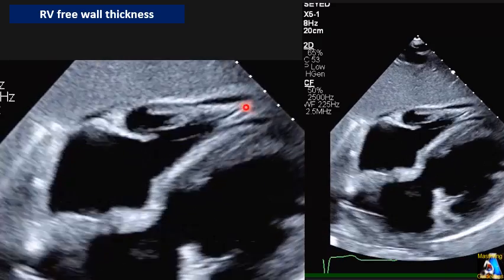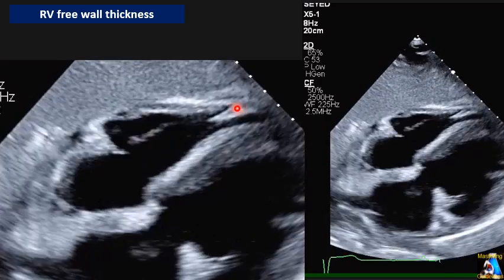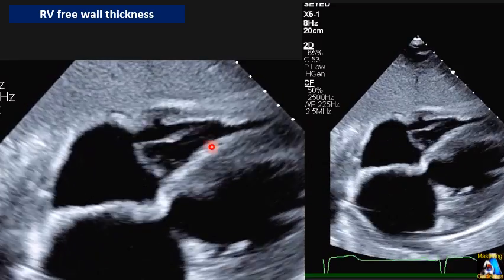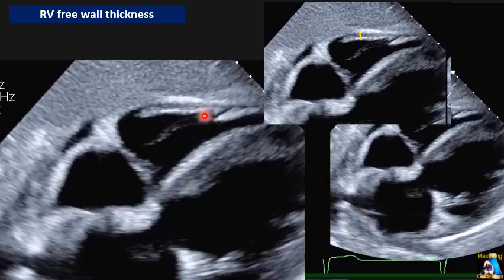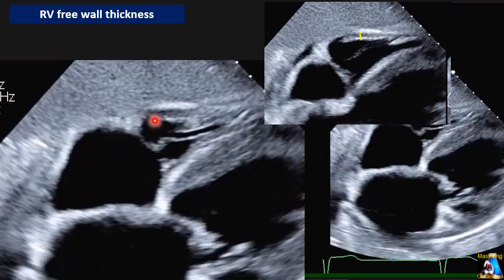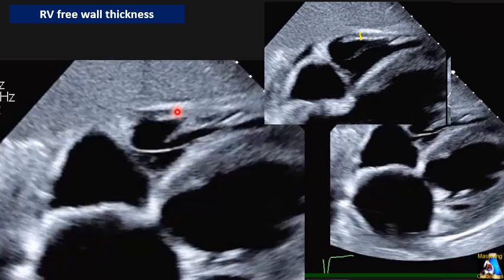In this case, you can see a trace of pericardial effusion, and it tells you that exactly right before this fluid on echo is your epicardium. Follow that line and that will be your epicardium. For measurement, one spot: you put one cursor and freeze it, at the end of diastole, close to the papillary muscle, before the papillary muscle, any spot that gives you clear thickness and border, but not at the annulus, a little above the annulus, because here, as you can see, it is usually thinner. So some spot before the papillary muscle is best at this level.